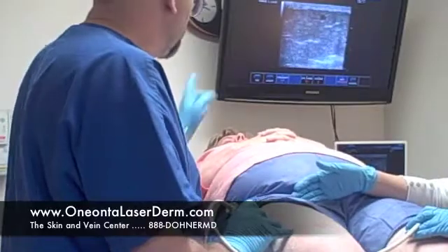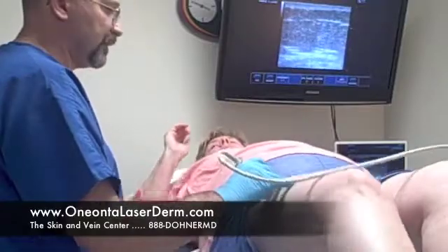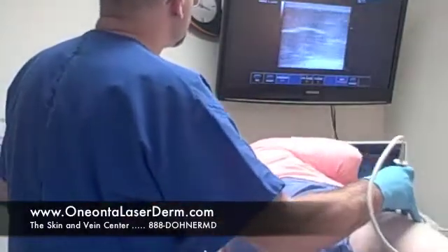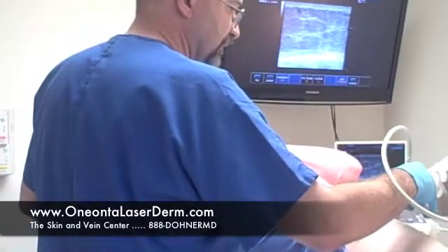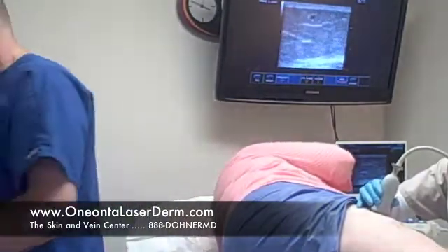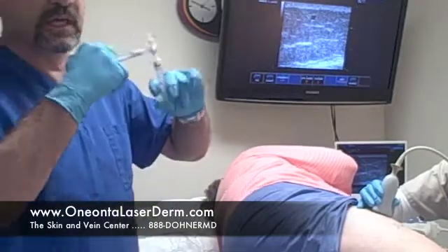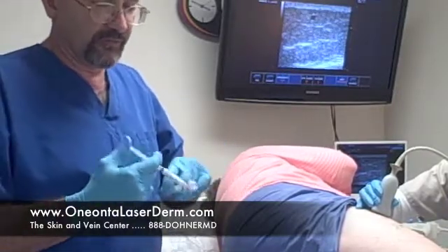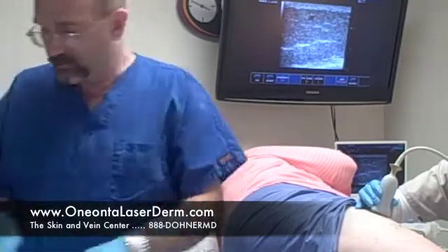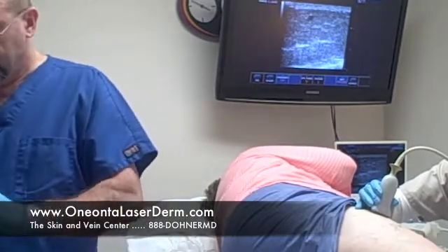I'm going to have this young lady turn on her side towards my nurse Holly. So I'm mixing up the medication — you can see there's a little apparatus — and I'm making the foam to be high quality and very dense. This will last for a few minutes while I'm doing this. Putting the needle on.